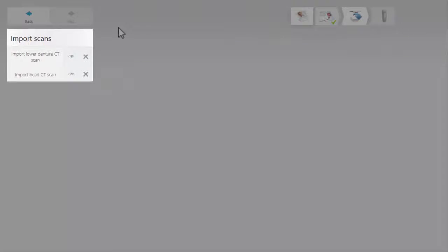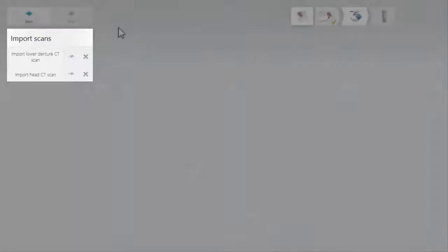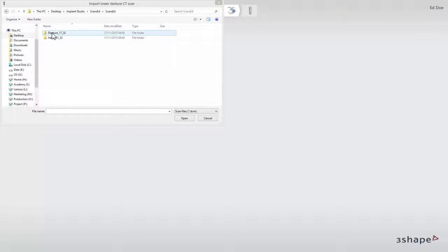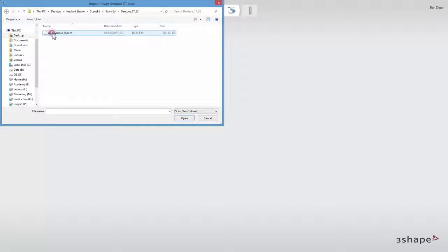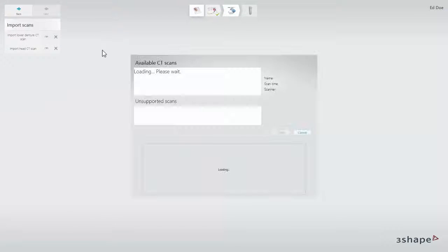In our example, we will use only a lower denture and a head scan. Click the Import Lower Denture CT Scan button and browse to find the correct DICOM file. You can preview it in the pop-up window.